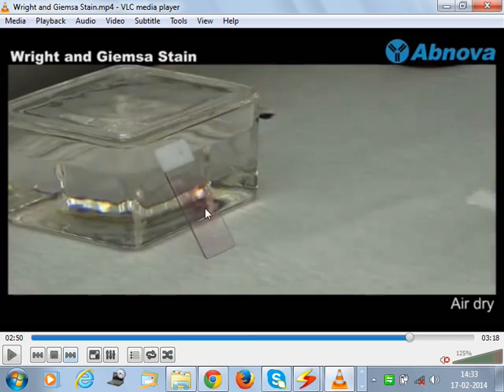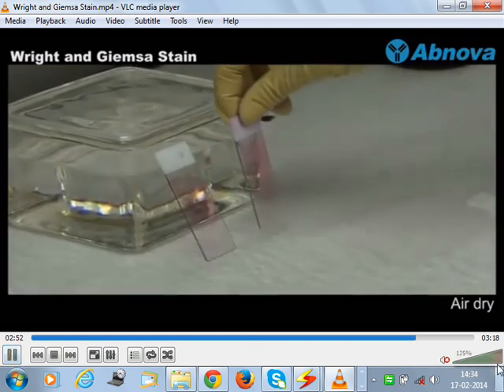But again, please note, for some people the smear will peel off when they do it. If it peels off, I can't do anything, I can't stick it back. What you should do is clean completely and then do it. It is difficult even now, it will be more difficult when you do it. So do it with a lot of care. If you do the steps rightly, it will be fine.